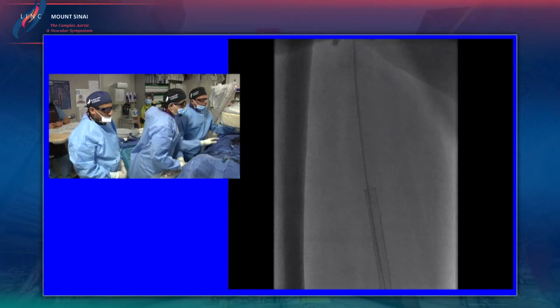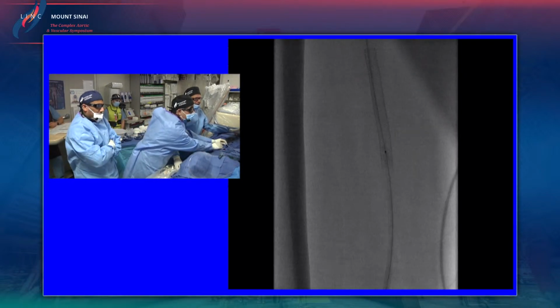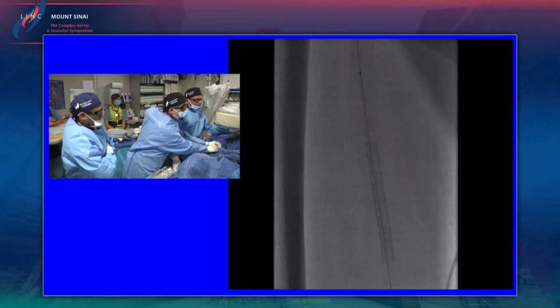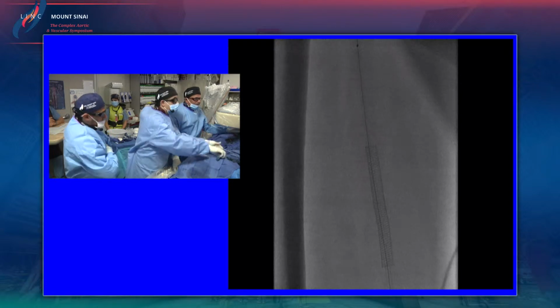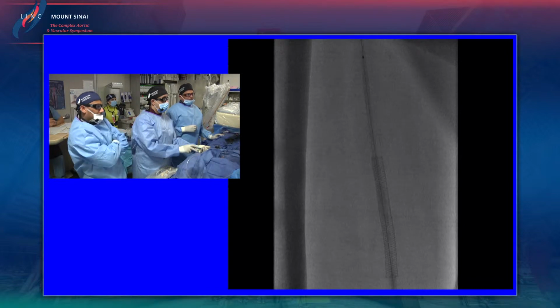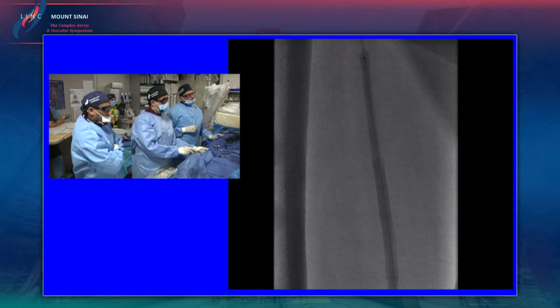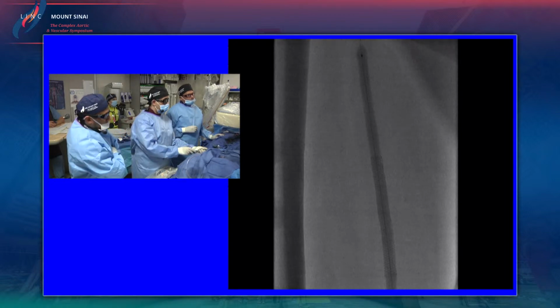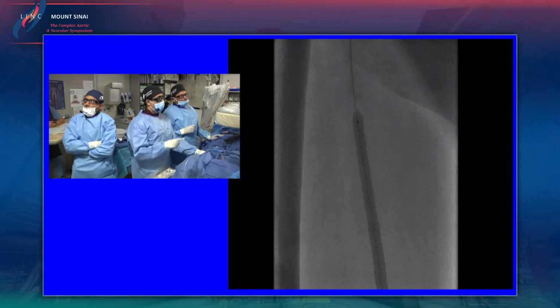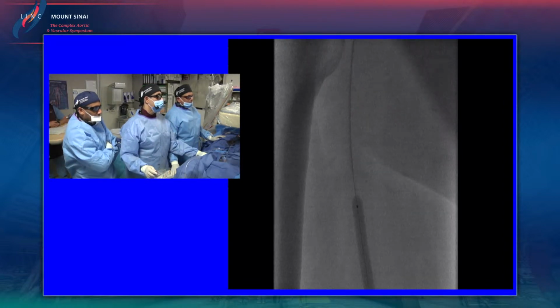Okay. So we'll just go ahead and show you how this looks after the balloon. And I'm curious here, what would everybody's final therapy be here? Say this balloon turns out that it's nothing, or we have minimal embolization. Go up here, and then would somebody do a DCB or a DES in this particular case? I think your post-chocolate angiogram is going to tell you what to do next. If there's a lot of dissection, then you're going one route. If there's a lot of debris, you're going another route. If it looks pretty good, then all options are on the table, including DCB.